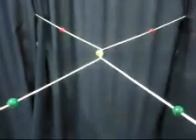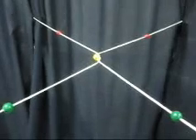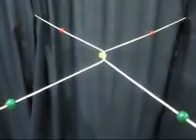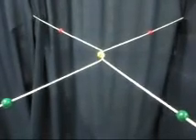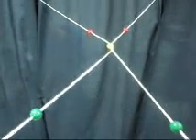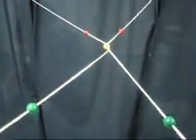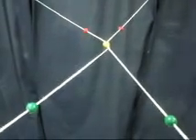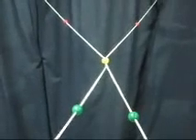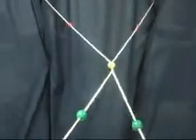The patient will see an X-pattern with the middle of the X crossed at the yellow bead where the patient is focusing. Only one yellow bead is seen, while two red beads and two green beads will be seen respectively. The separation between the two red beads and the two green beads should be the same. The patient will see a different pattern if she does not have enough divergence — the separation between the two red beads will be smaller than the two green beads. If the separation between the two green beads is smaller than the two red beads, this shows that the patient converges too much.